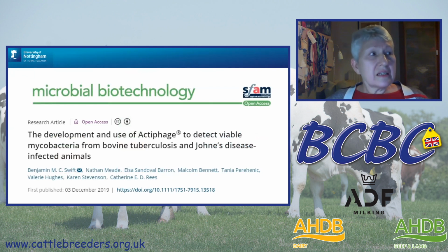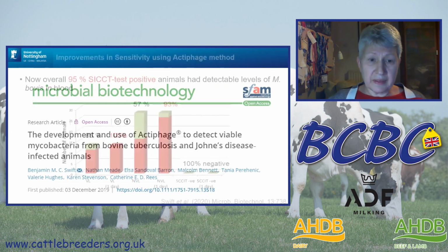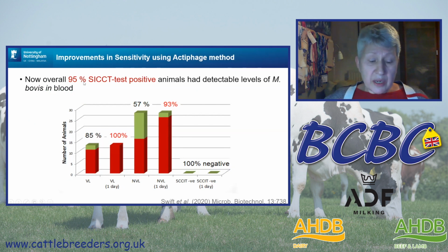However, that first study we published was all done using the original test with the plates and the agar and the overnight and counting. And this year, we have now published the results of the same study carried out using the new simple test, the Actiphage method. Now, we said that going to that new Actiphage method should make things more sensitive. And what we found was that 95% of all the animals, these skin test positive animals, had detectable M. bovis in the blood. So it's much more encouraging that this method now is working.